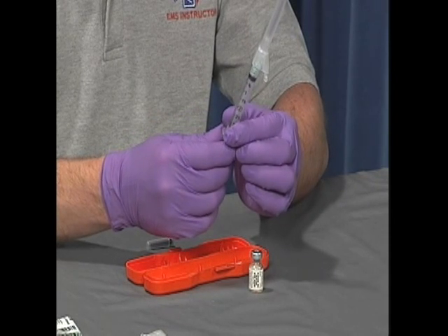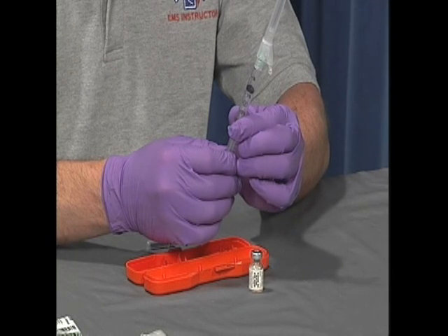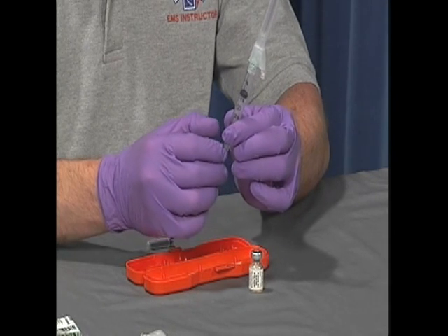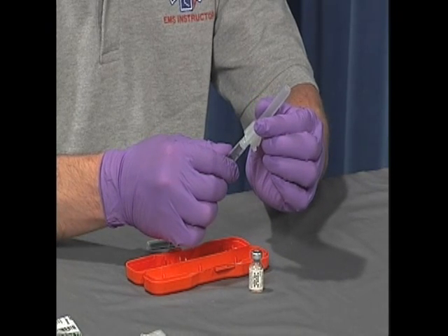Continue with the drawing up of the medication using a new needle and syringe, repeating the same steps. First, draw up the same volume of air as the volume to be withdrawn.